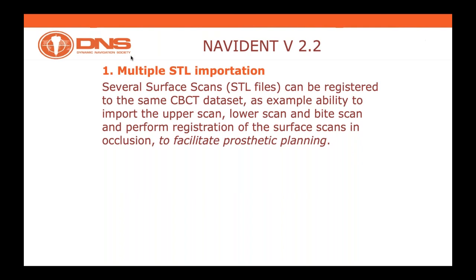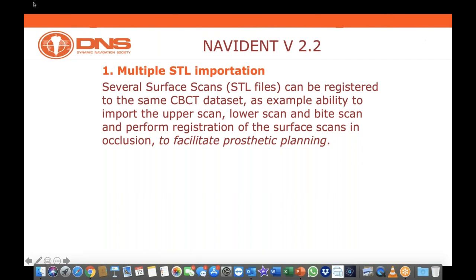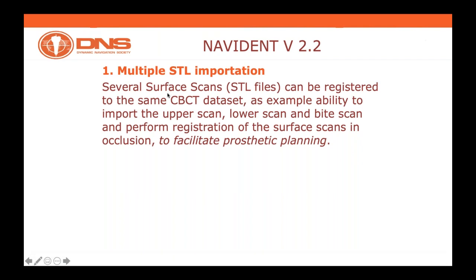First, we're talking about the opportunity to add and import multiple STLs. We will see that thanks to this feature, we can register multiple STL files to the same CBCT dataset. I'll provide an example of how to achieve that by importing the upper scan, the lower scan, and the bite scan and registering them all together. The benefit is to facilitate prosthetic-driven planning.